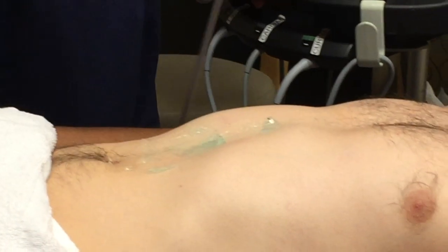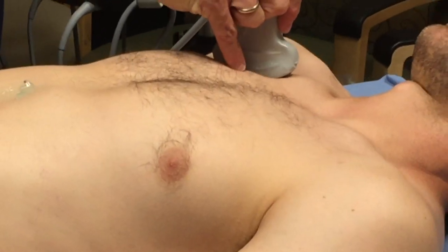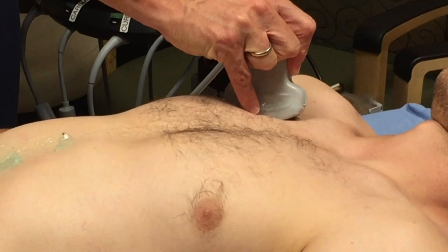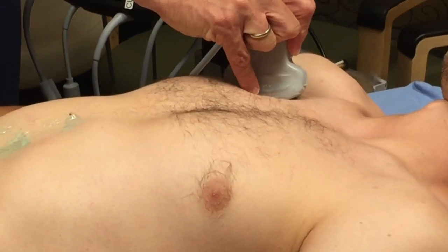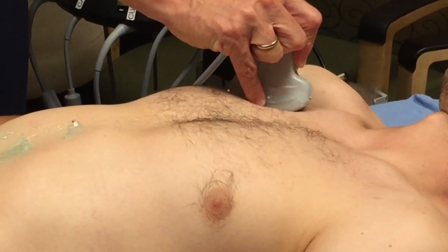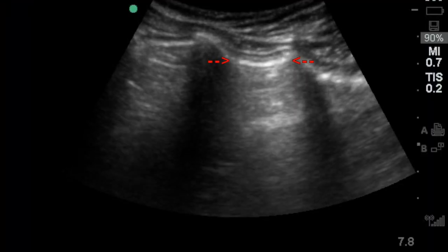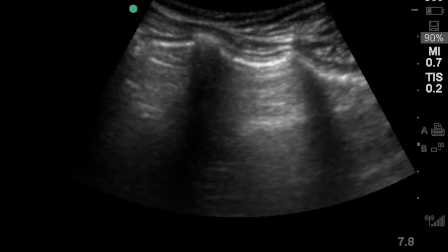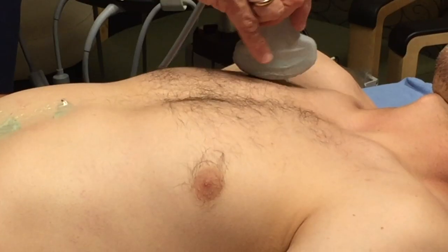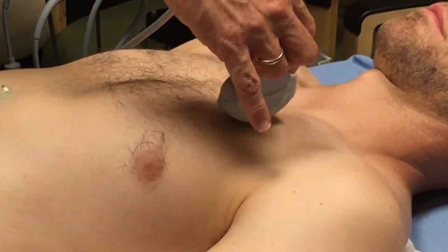For pulmonary on the HI-MAP or RUSH exam, I usually set the probe at the apex of the lung, perpendicular to the ribs, looking at the rib shadows. I'm looking for sliding of the lungs. We'll look at both sides, again perpendicular to the ribs.